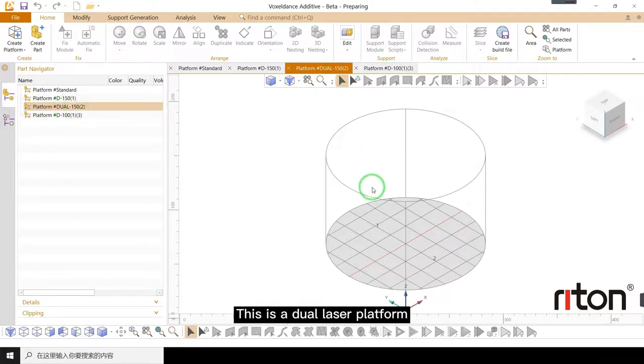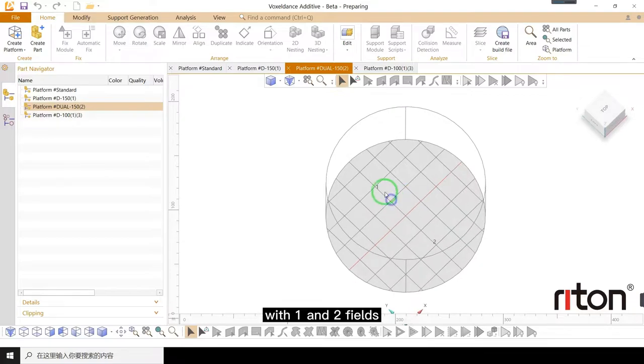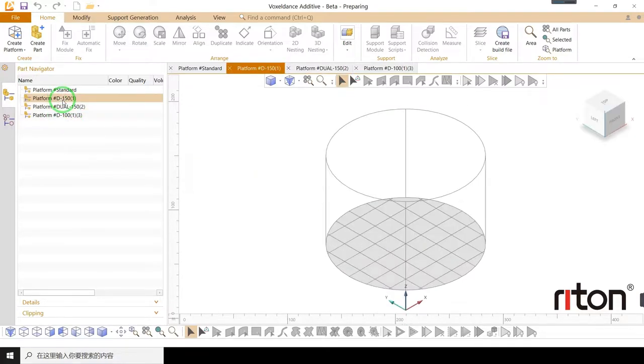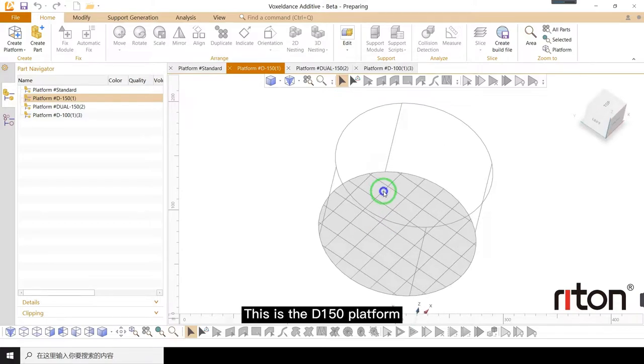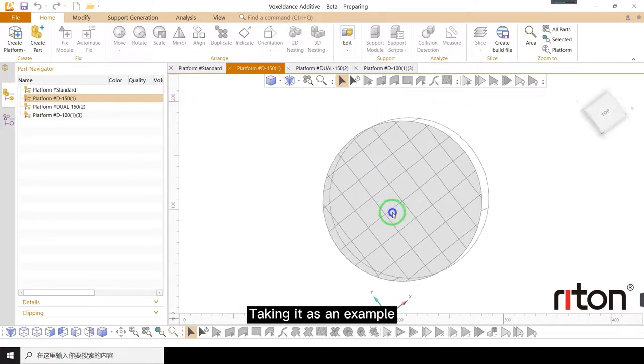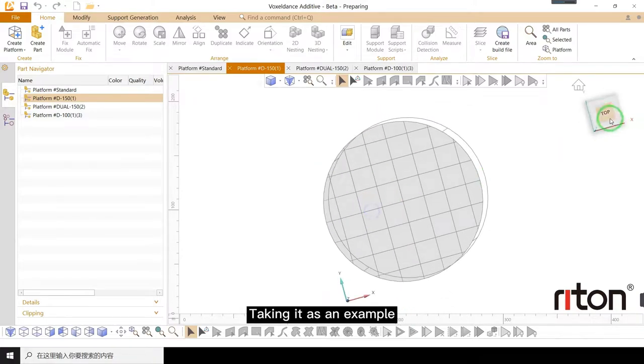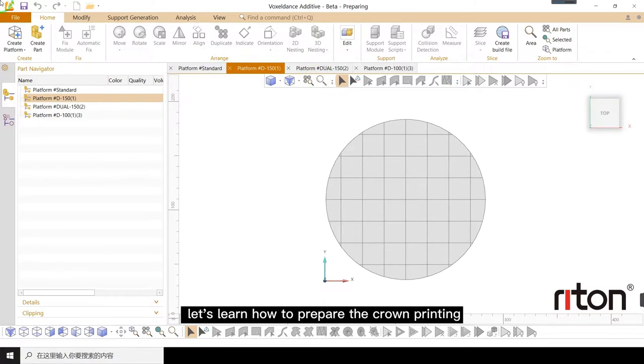This is a dual laser platform with one and two fields. This is the D-150 platform. Taking it as an example, let's learn how to prepare the crown printing.